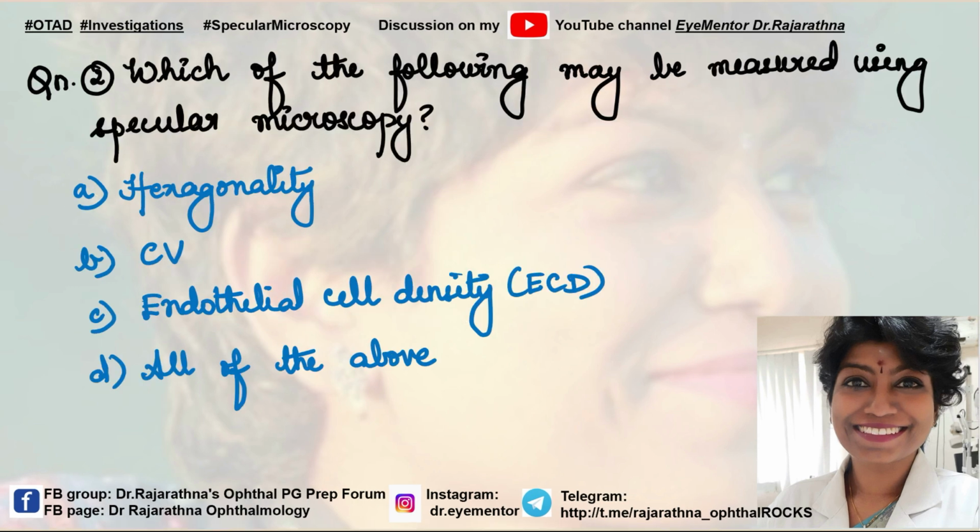Now, second question. Which of the following may be measured using specular microscopy? Hexagonality, CV, endothelial cell density, all of the above. Now, all of you know that endothelial cell density can be measured by specular microscopy. What you probably do not know is that even hexagonality and the coefficient of variation can also be measured on specular microscopy. So the answer is again all of the above. Now, what is hexagonality and what is coefficient of variation? I'll be telling you so that if they ask you anything more, you should be able to answer.